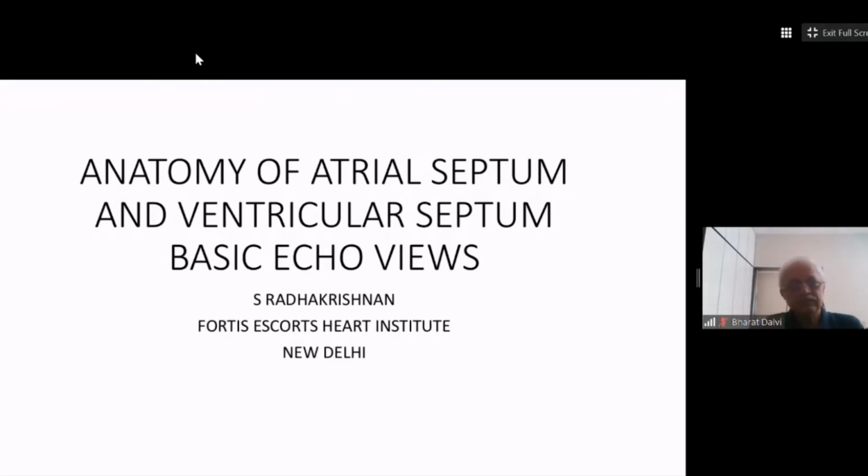I spoke to Nagesh day before yesterday as to what he wants from me, because this is an interventional meeting. Even I'm not sure whether this is an appropriate forum for this particular talk, but I decided to concentrate on the anatomy of the atrial and ventricular septum, and also the echo pictures of how we classify atrial septal defect and basic ventricular septal defect. It may not be directly related to the interventional aspect of this whole thing, but you have to bear with me.